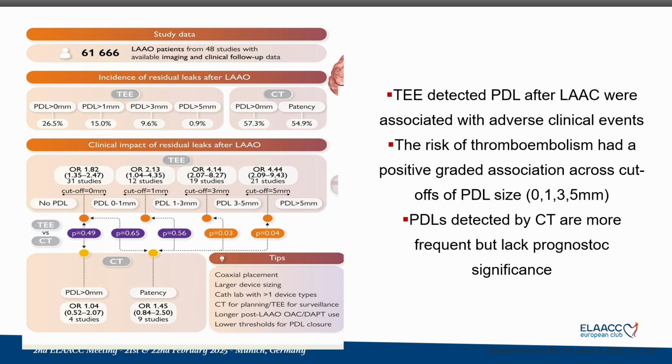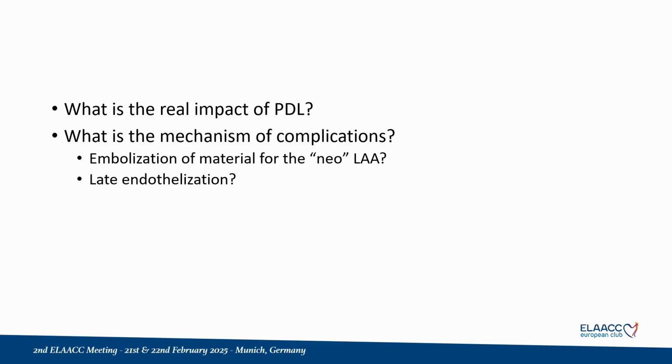And I think it's a big problem, because some centers are doing the follow-up with TOE and other ones with CT. I think that today or along this year or whatever, we need to agree on some common definitions. And I think that we need better studies to really define what is the impact of these leaks.